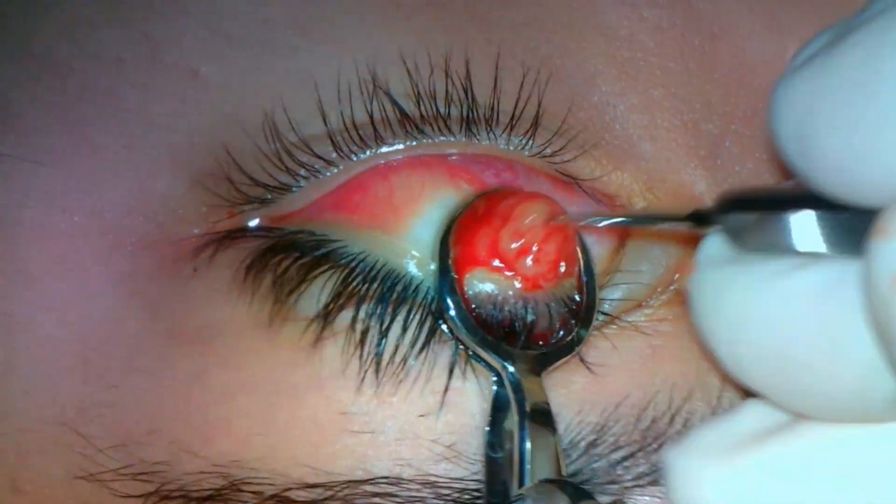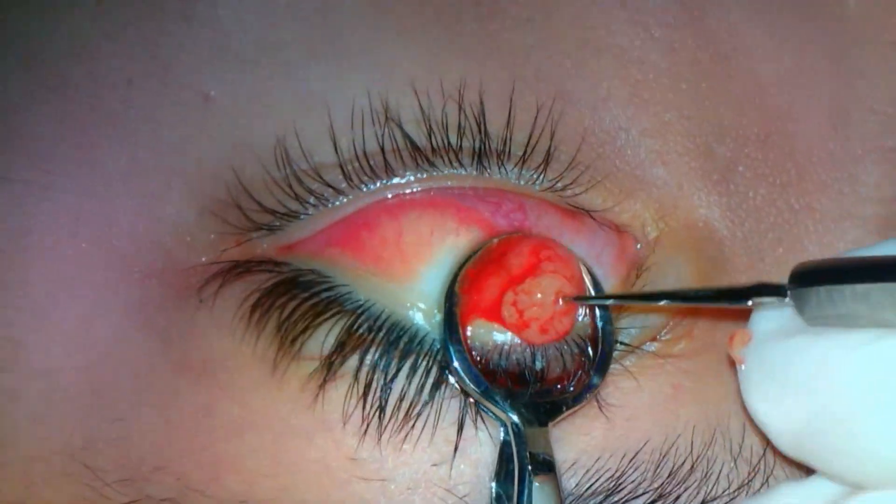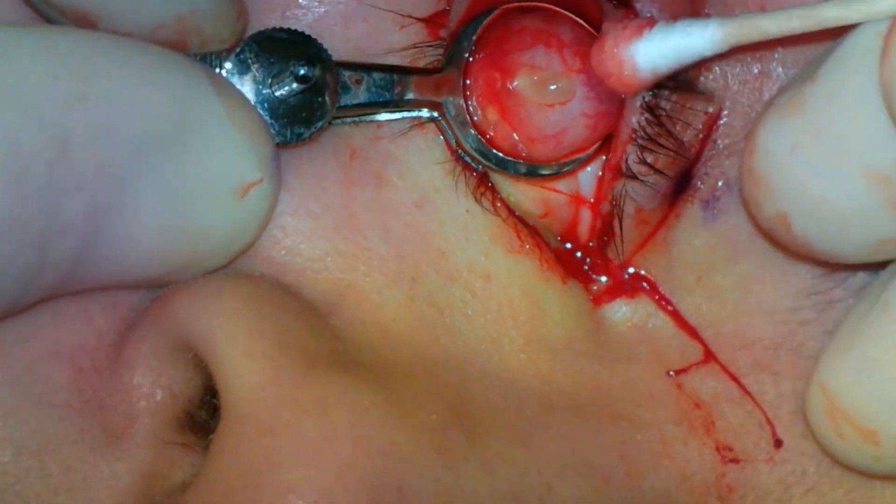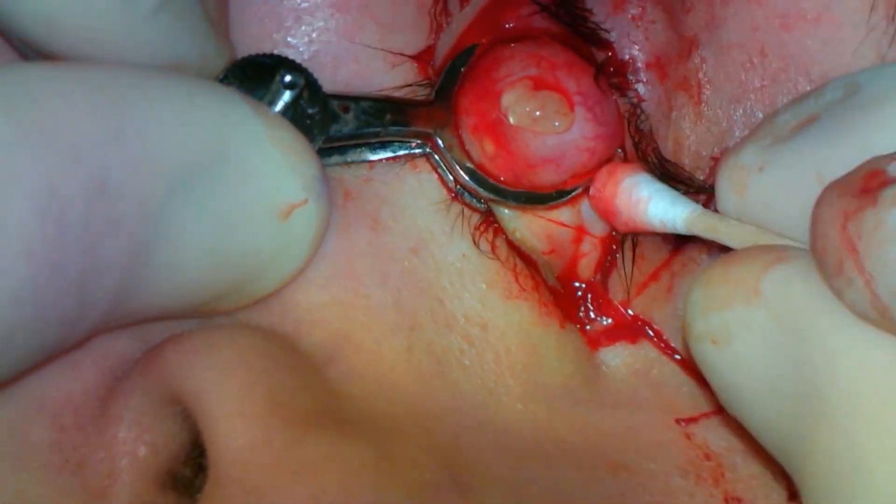Some more upper lid chalazia with the same procedure. A lower lid chalazion with copious contents. Histopathological analysis of this material shows lipogranulomatous inflammation.